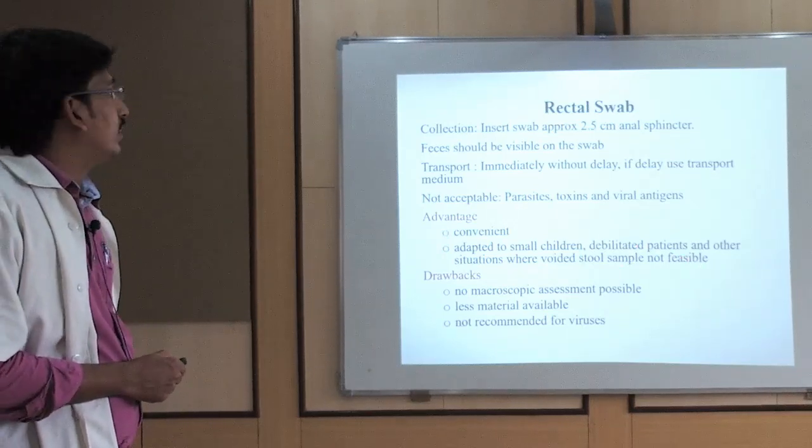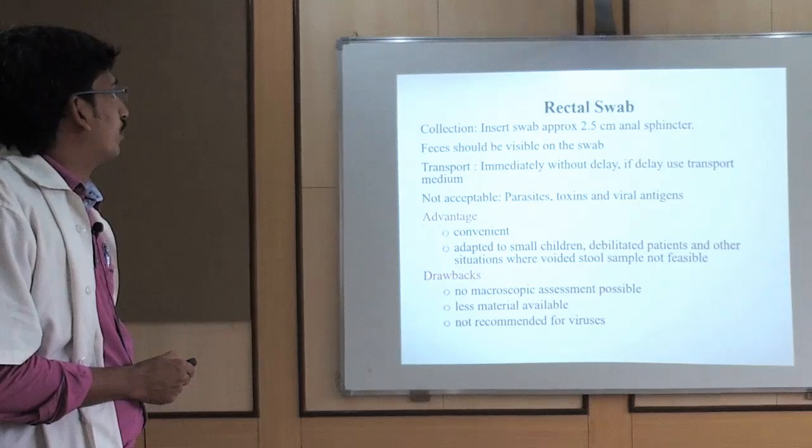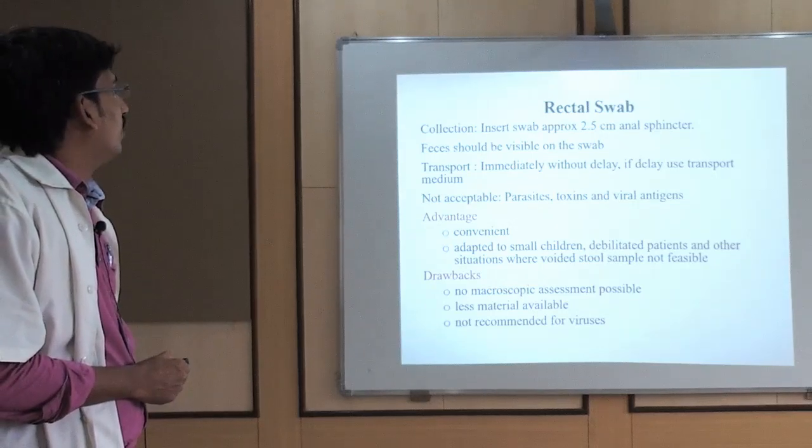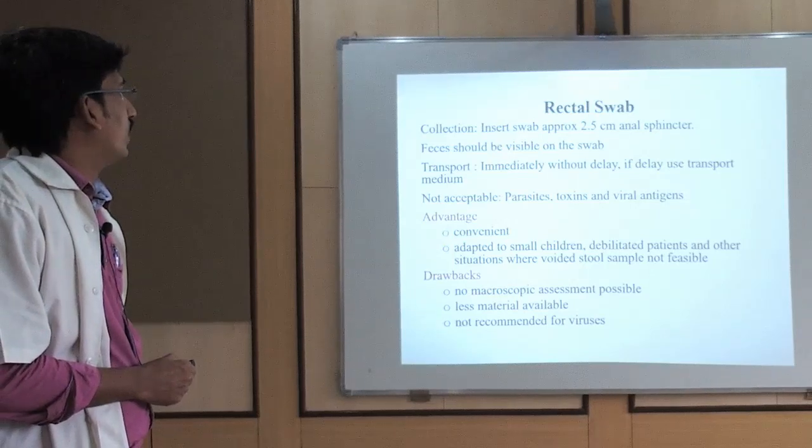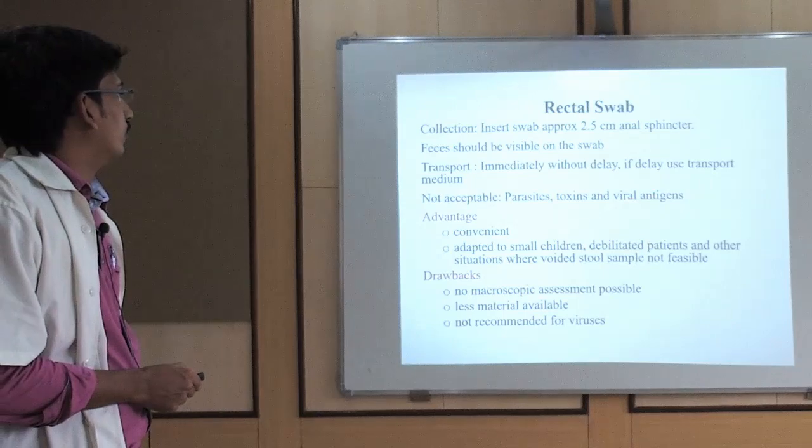Coming to collection, insert the swab approximately 2.5 cm past the anal sphincter, and feces should be visible on the swab. Then you have to take it out and transport immediately without any delay. If there is a delay, use transport media.